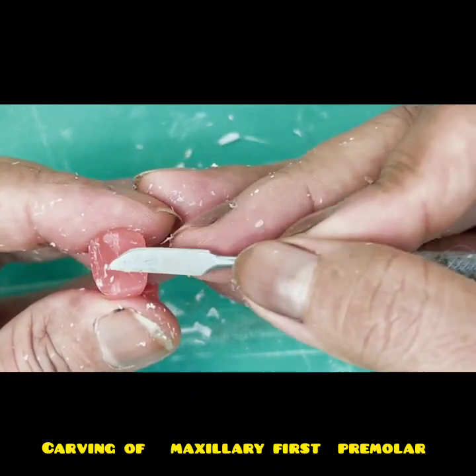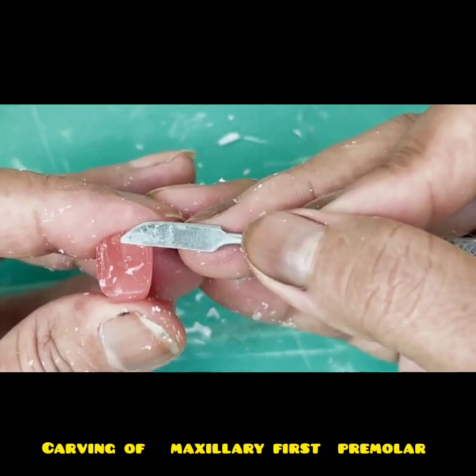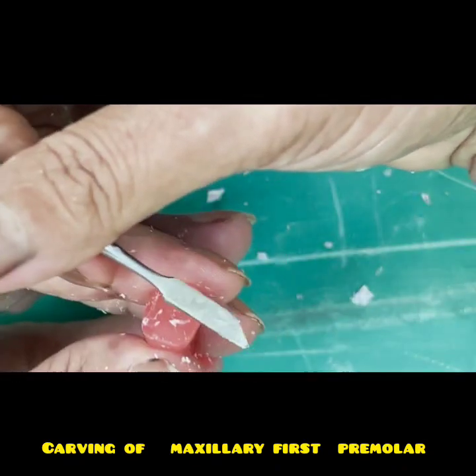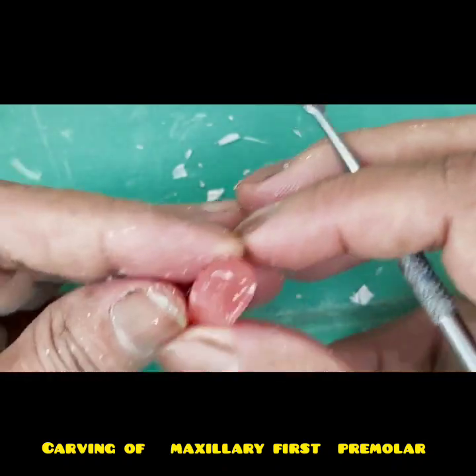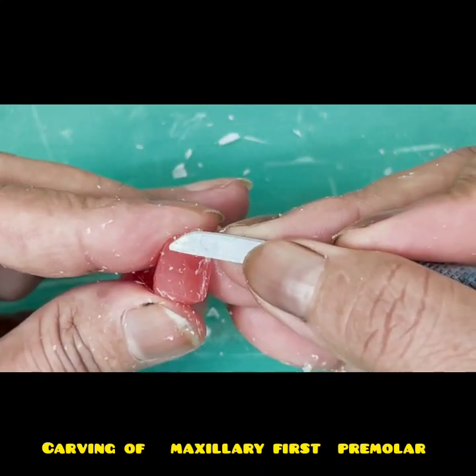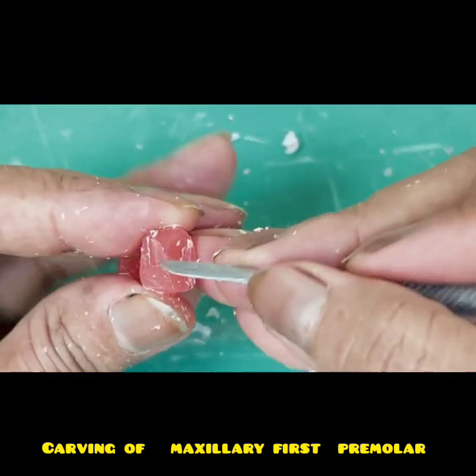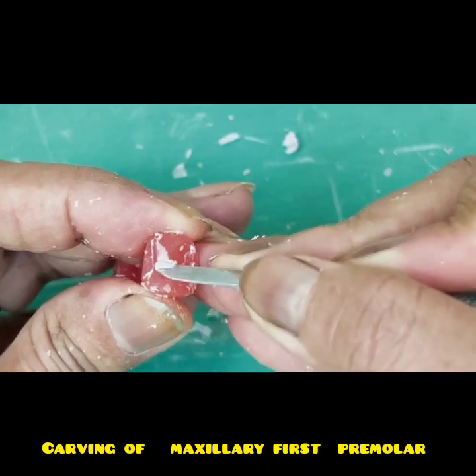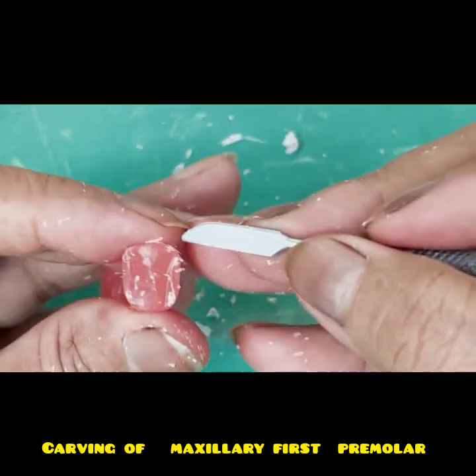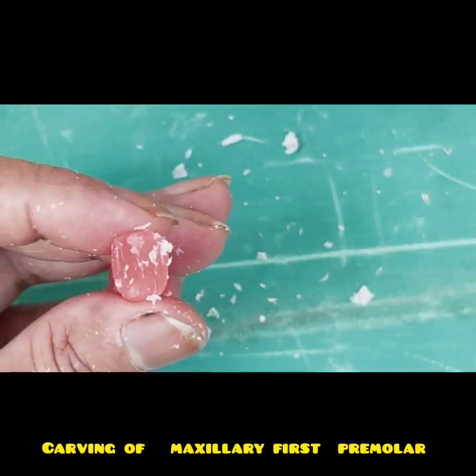Now when you do the other side, see the position of the carver. The tip of the carver is facing towards the center, which is wrong. I had told you the tip of the carver should face towards the periphery. So if I do like this, it will be inconvenient. So what I'll do is I will turn my block, and same procedure I will follow for the opposite side. Okay, so my occlusal surface is already in an inclined position, and I have to just give the cuspal inclined planes like this. And then lastly, remove the step of the marginal ridge and polish it.